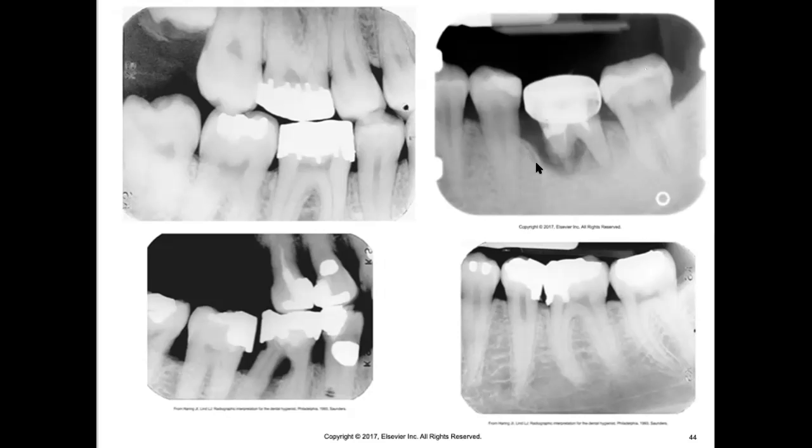And here we can see some very severe bone loss. It's all the way around the furcation areas. There is literally nothing holding on to this tooth beside this small area around this distal root here. And it's because there's been so much bacteria that has probably gotten up underneath this crown and just kind of eaten its way through the periodontum.